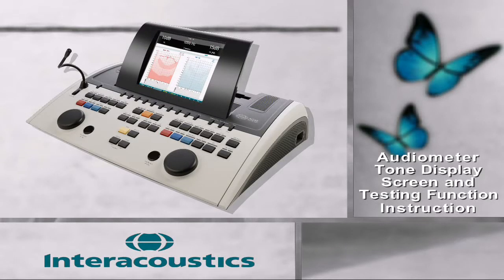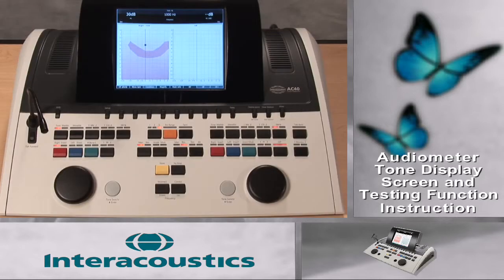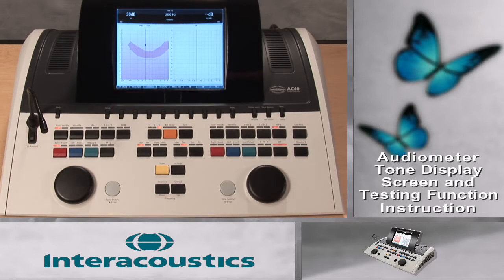The Tone screen provides visualization of the audiometer settings and testing results while conducting pure tone audiometry. This video series will explain the use of the function keys that line the bottom of the screen. The audiometer keyboard button overview can be viewed in a separate video series.